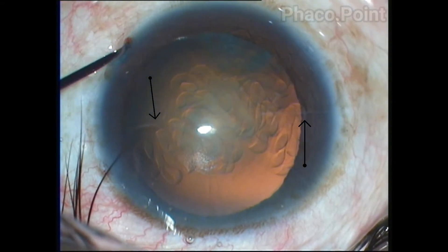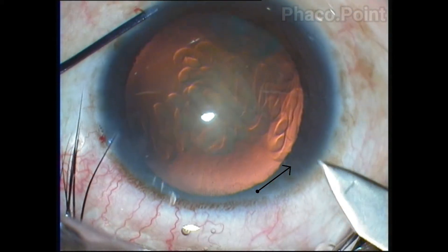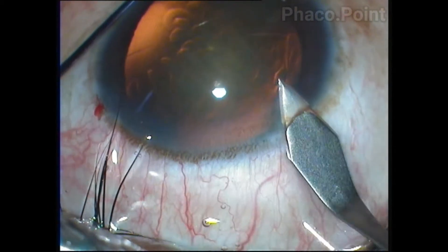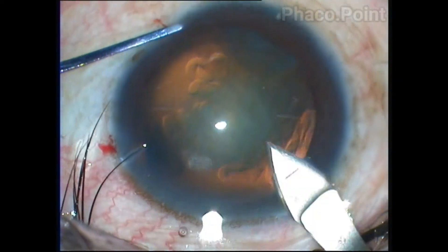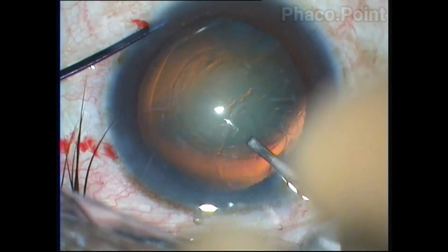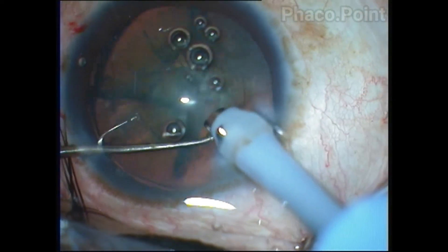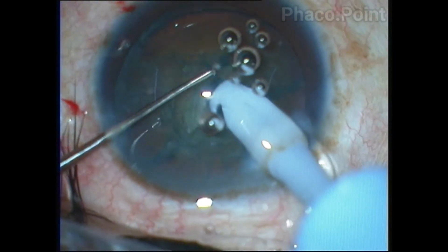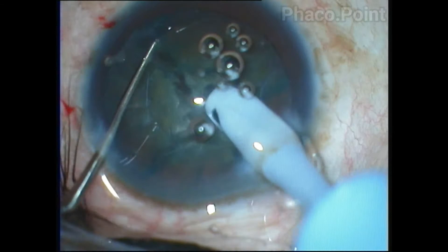I start off by making the incision using a 2.8 keratome, bisecting the radial mark that I have made coinciding with the site of incision marks. Once this is done, a properly sized capsulorhexis of 5 mm is completed. This is important to give rotational stability to the toric lens, because the bag has to overlap the optic margin.